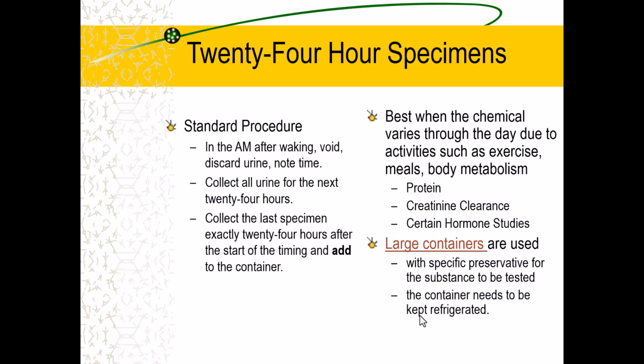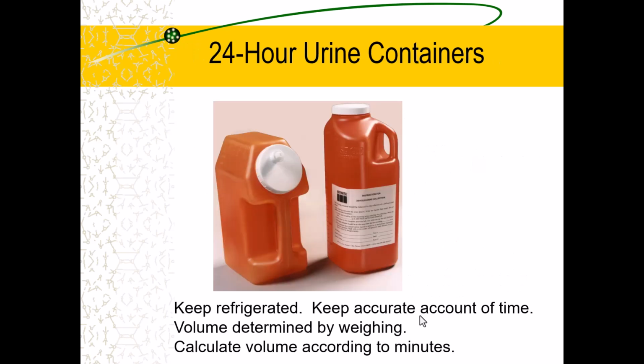We always suggest putting ice in a cooler and keeping it next to the toilet, even maybe. I ran out, I really had to go to the bathroom, so we missed one. I forgot to collect my next morning. It's really, really hard. The patient compliance can be the worst piece of that. That's why it's really important to tell them the instructions, emphasize the importance, and give them the handwritten instructions, or the written out instructions. These are what those urine containers, some of them look like.